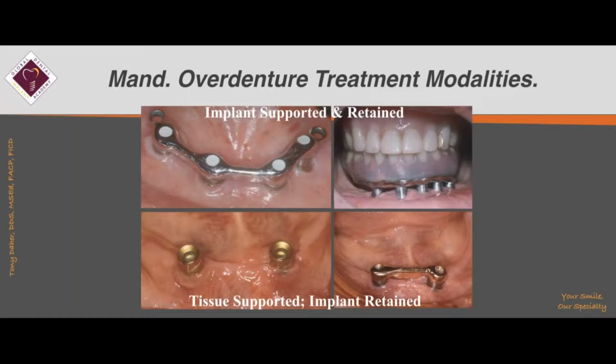Biomechanics is very important, and because of this, your treatment sequence and protocol are going to depend on the type of prosthesis that you're going to be making.